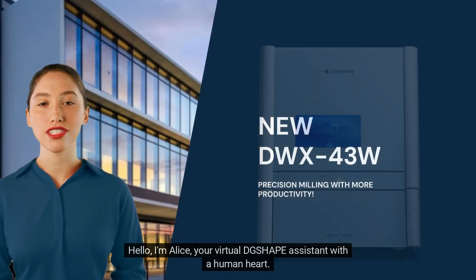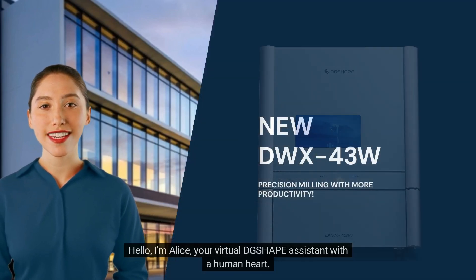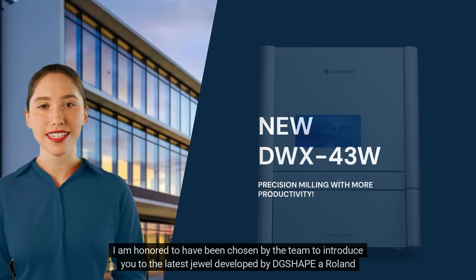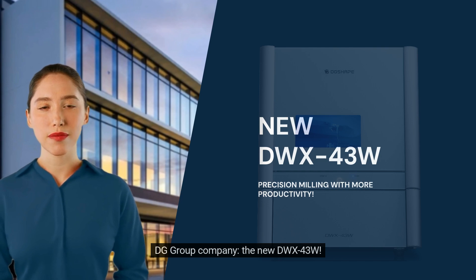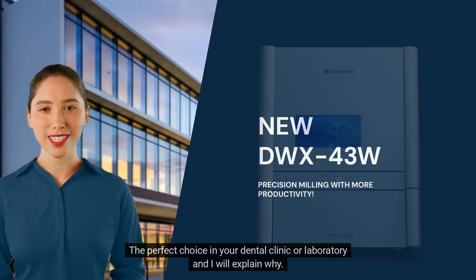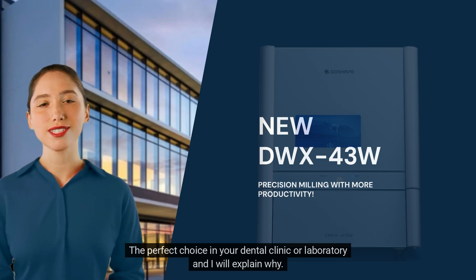Hello, I'm Alice, your virtual DG Shape assistant with a human heart. I am honored to have been chosen by the team to introduce you to the latest jewel developed by DG Shape, a Roland DG Group company — the new DWX43W, the perfect choice in your dental clinic or laboratory. And I will explain why.